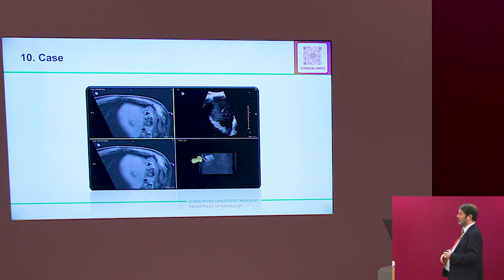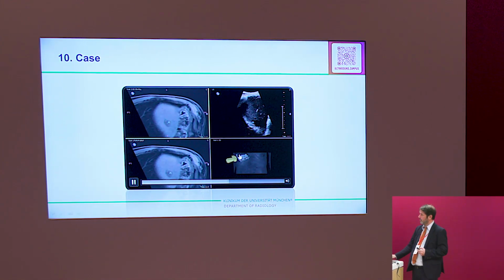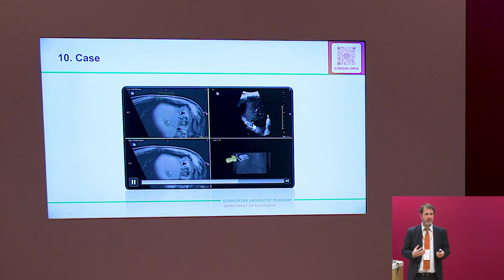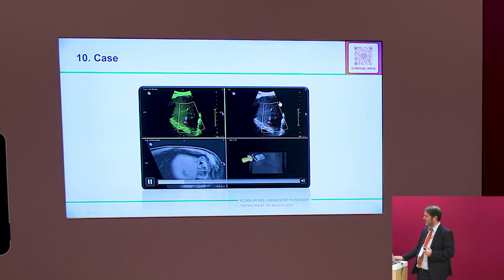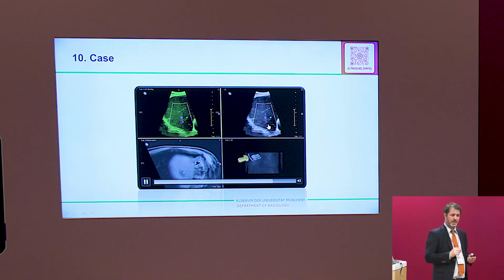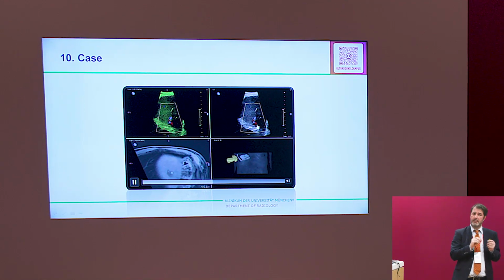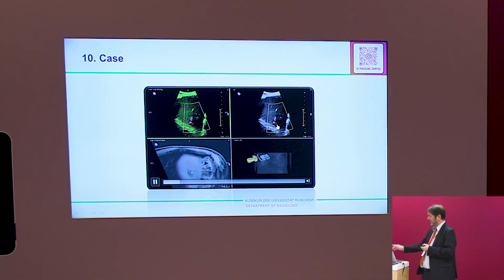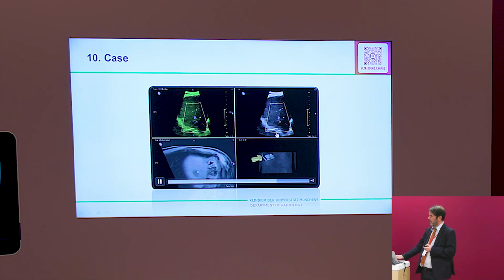So you see, we use the MRI for fusion. We see there's a lesion. It doesn't really look like a solid lesion. And look here. We could see a lot of flow. You see these blue and red areas? This is very atypical because if you have a small met, you see only very tiny vessels, not such a big one. So something is wrong. But you see in the MRI, the registration was fine, exactly there.